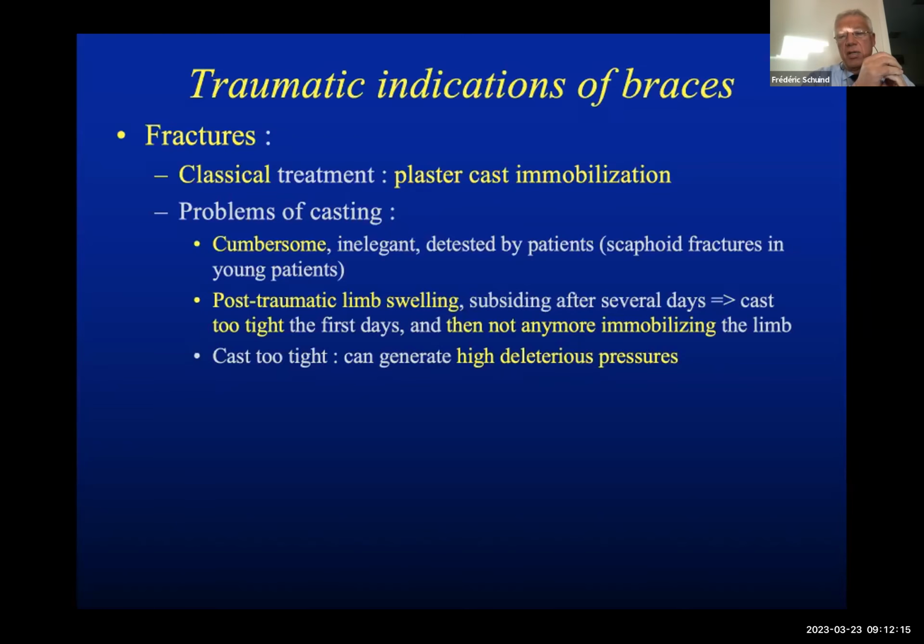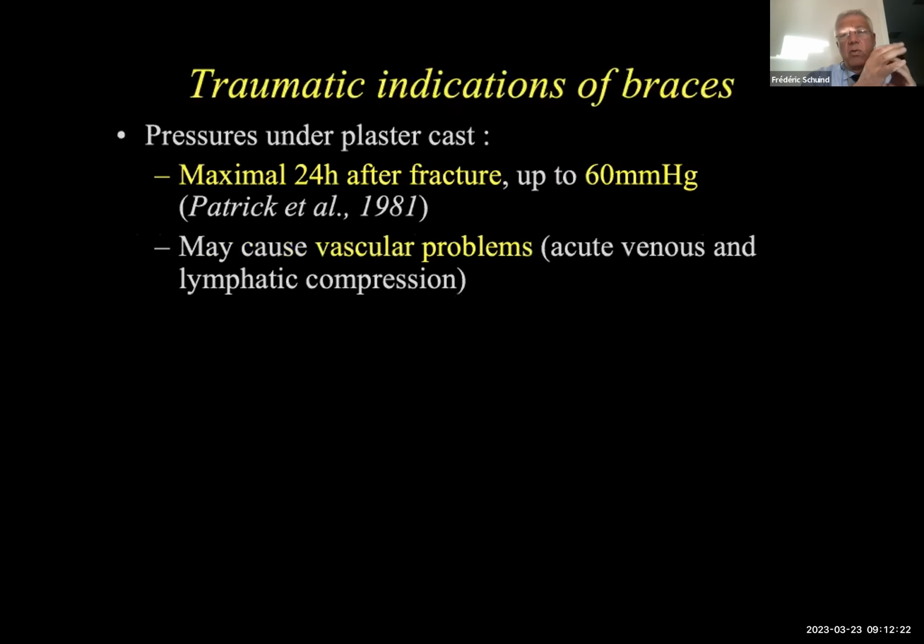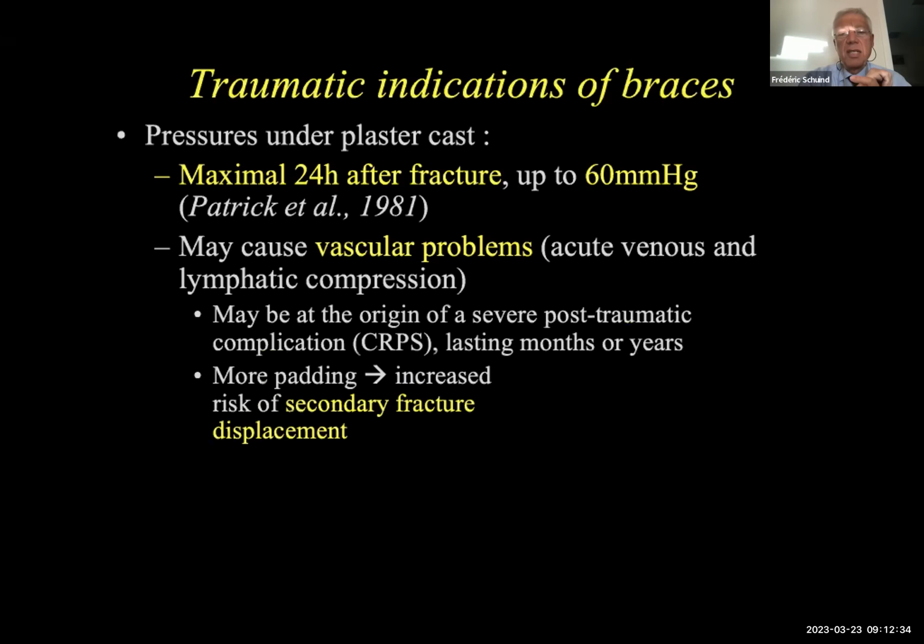And high pressures on the plaster cast can go up to 60 millimeters of mercury, can cause a compression of veins and lymphatics, and these can lead to a very serious, very severe complication called CRPS that will have sequels for months and years. Of course, you can avoid high pressure by more padding, but then there is an increased risk of secondary fracture displacement.